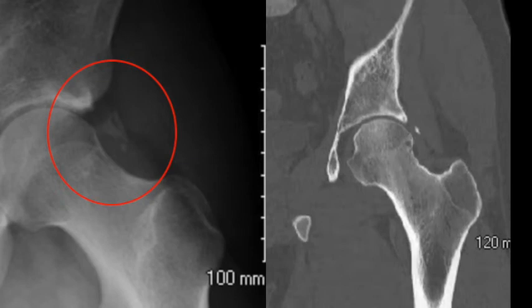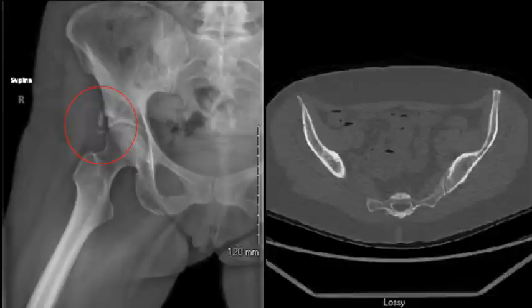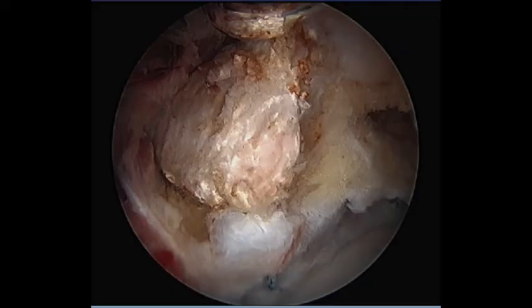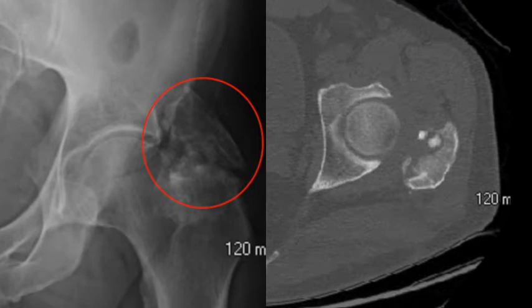If arthroscopic surgery is planned to address other intraarticular pathology or FAI, arthroscopic HO removal can be accomplished simultaneously. Some cases require an open approach, especially if the HO is located extraarticularly.